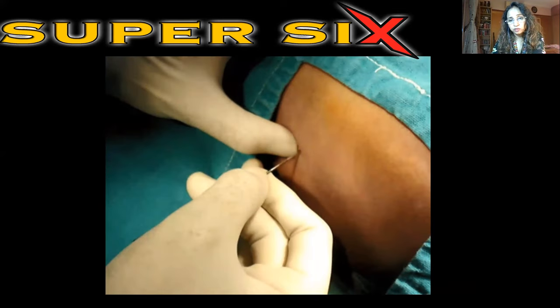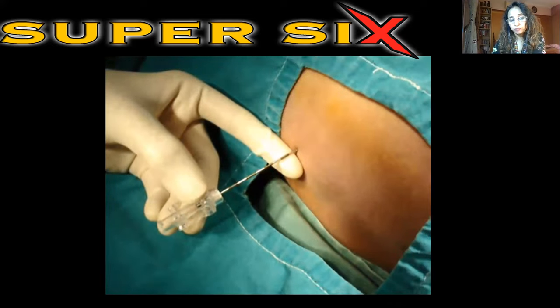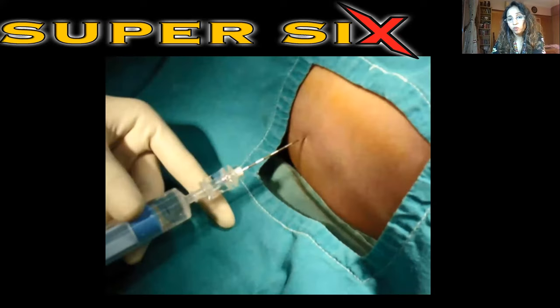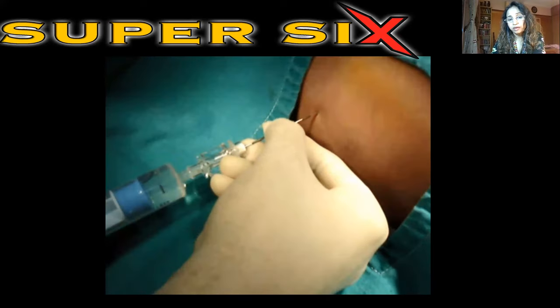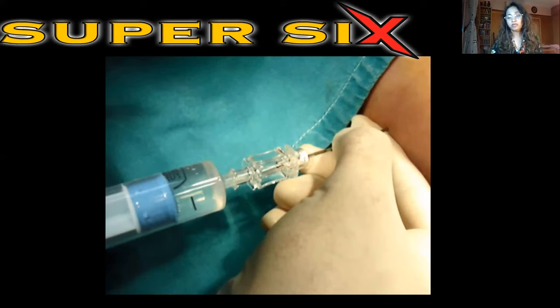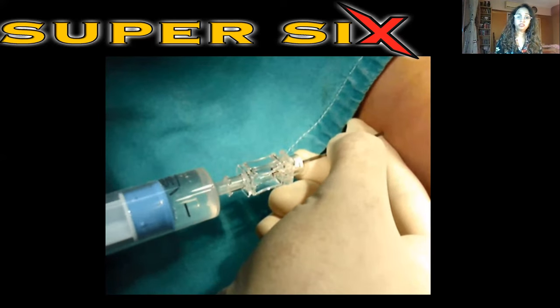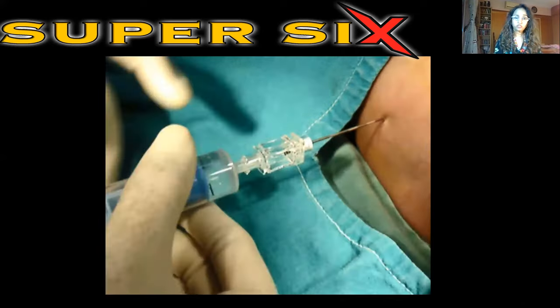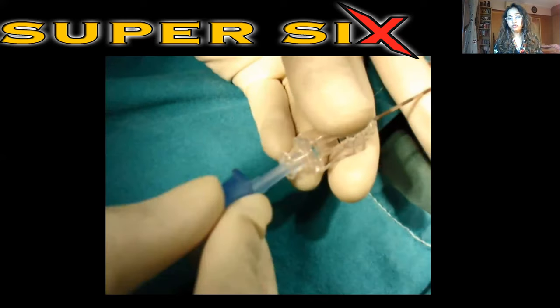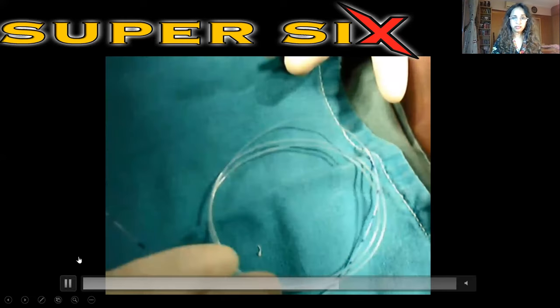Skin insertion and subcutaneous tissue insertion. Then we remove the stylet. We attach the LOR syringe filled with saline to it. Once the assembly is created, the dominant hand holds the needle and the non-dominant hand pushes the plunger. Very gently, the entire assembly is advanced ahead till the give of the ligamentum flavum is felt and is actually elicited, which is unmistakable. The introducer is put in and the required amount of epidural catheter is inserted inside.